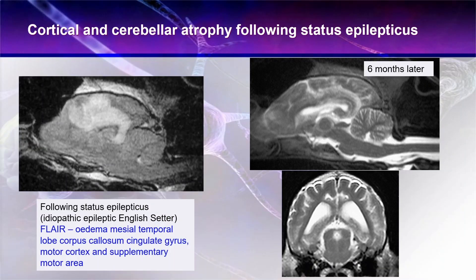Here is another example. This is an English setter that was presented in status epilepticus. It had idiopathic epilepsy and developed status epilepticus because it had very bad epilepsy and hadn't been started on treatment promptly enough. You can see the edema coming up through the temporal lobe and hippocampal region, going through the corpus callosum, through the cingulate gyrus, and right up into the motor cortex and supplementary motor area — showing where the seizure is spreading through the neuronal networks.